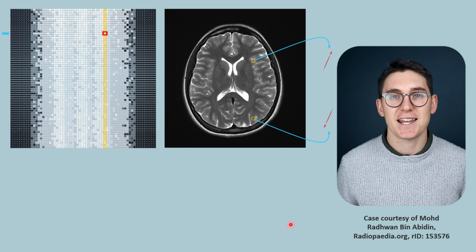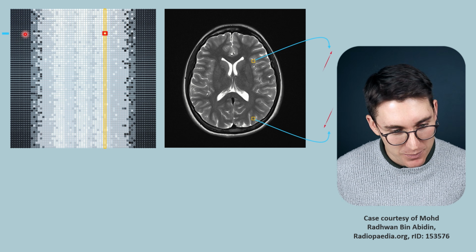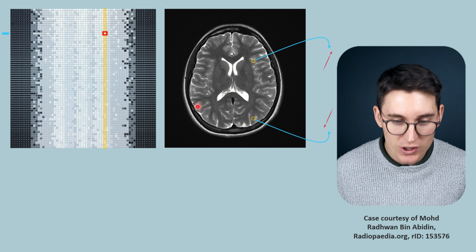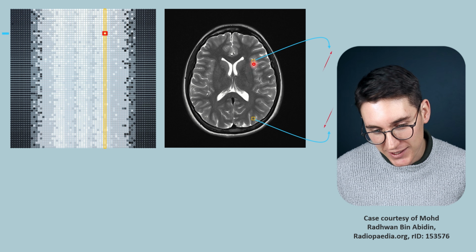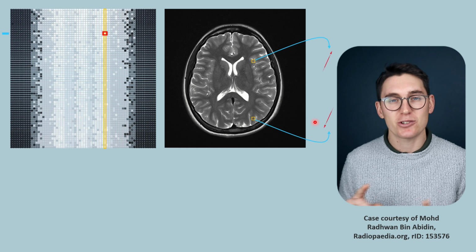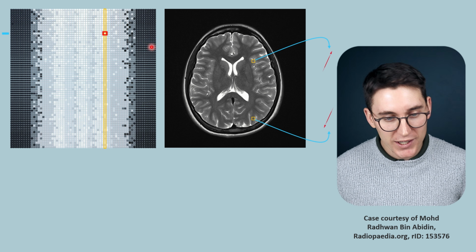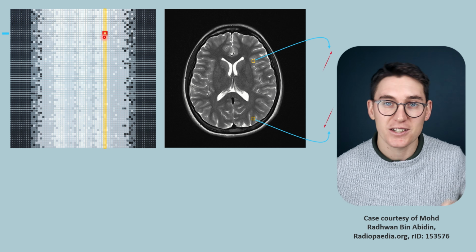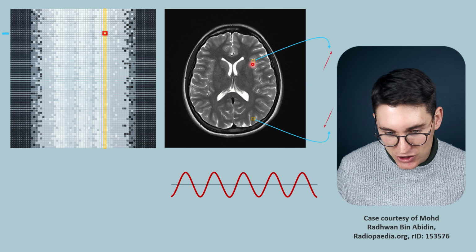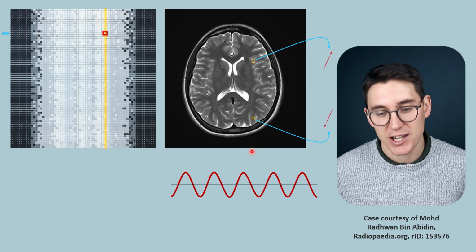Let's look at the second example where we've applied a specific amount of phasing or dephasing gradient to the y-axis here, which means that the pixels here are completely 180 degrees out of phase with one another. We can then use this data point in combination with our k-space to figure out what signal is being generated at this x-axis location.